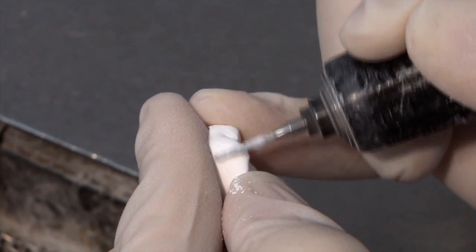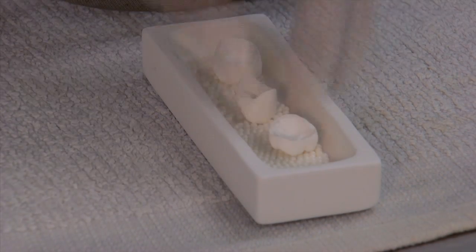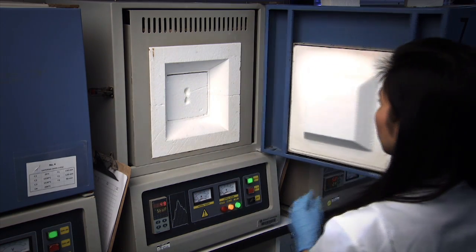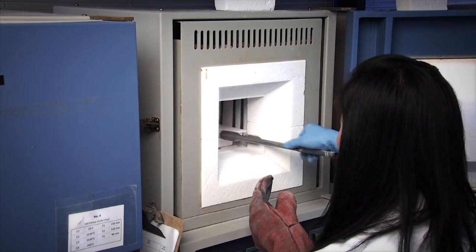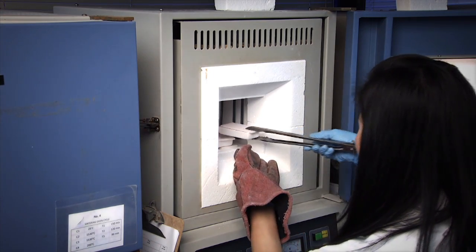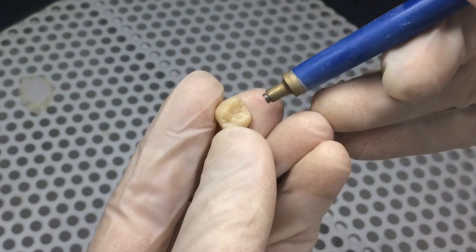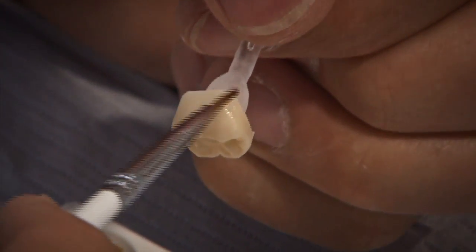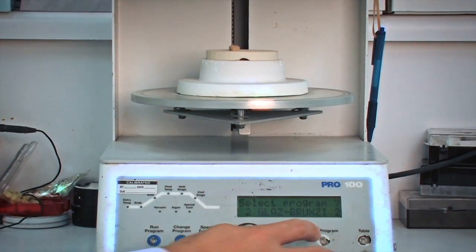The sprues are removed and the crowns are cut out of the disc, then placed on small aluminum oxide ball bearings. Because they'll shrink roughly 21% during nine hours in the oven, those ball bearings roll underneath the crown as it shrinks so there's no contact between the tray and the crown, which would distort its shape. Once it comes out we do some sandblasting to clean it up, then apply staining to match whatever color the dentist requested. The block started as an A2 but there's still characterization needed.